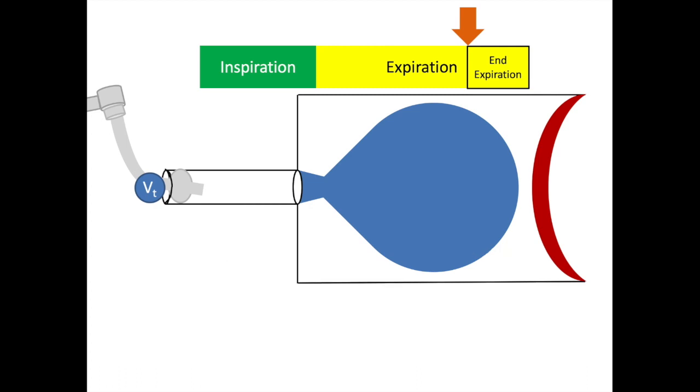The difference with the mechanical ventilator is that you can give positive end expiratory pressure. That is, instead of exposing the airway to atmospheric pressure, you can put a positive pressure here, and that's called PEEP, or positive end expiratory pressure. And that has a lot of effects that I'm not really going to get into here, but that's the only other important difference between a not mechanically ventilated patient and a mechanically ventilated one. So nothing's moving here at end expiration, all flow is gone, tidal volume's out of the lungs, and you're applying PEEP.